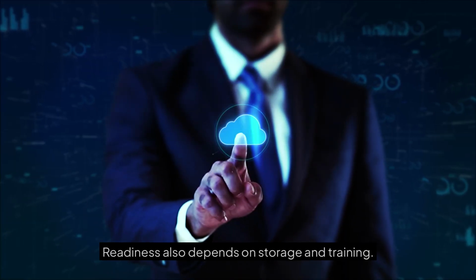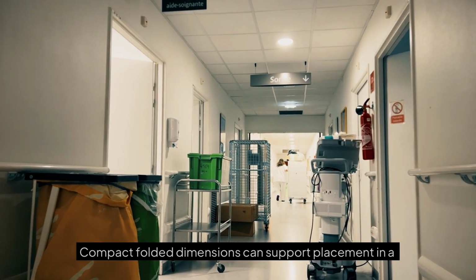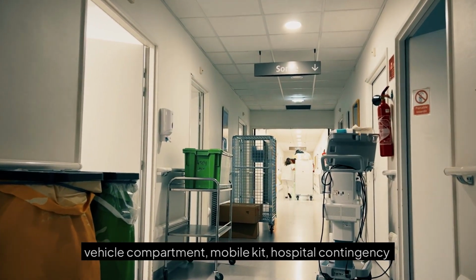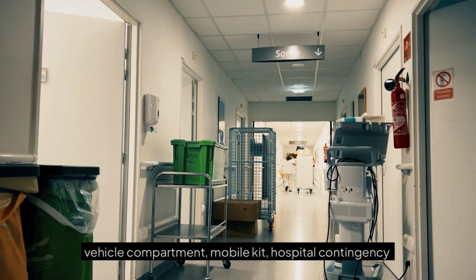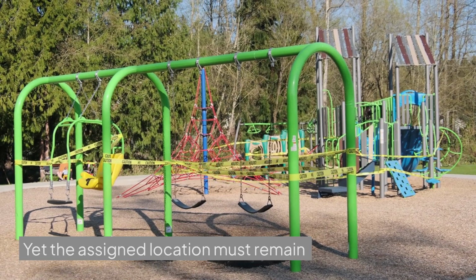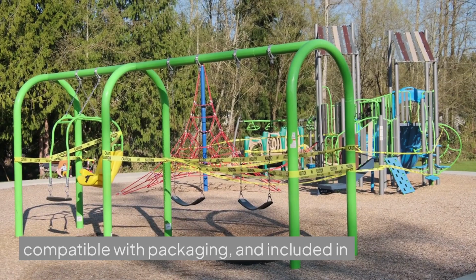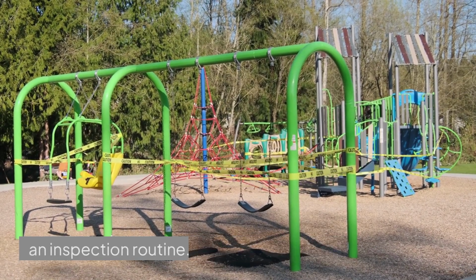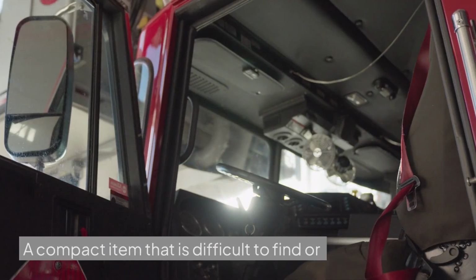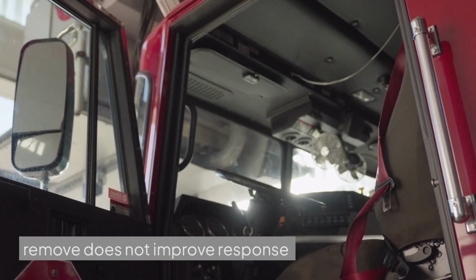Readiness also depends on storage and training. Compact folded dimensions can support placement in a vehicle compartment, mobile kit, hospital contingency store, or field module. Yet the assigned location must remain visible, protected from damage, compatible with packaging, and included in an inspection routine. A compact item that is difficult to find or remove does not improve response readiness.